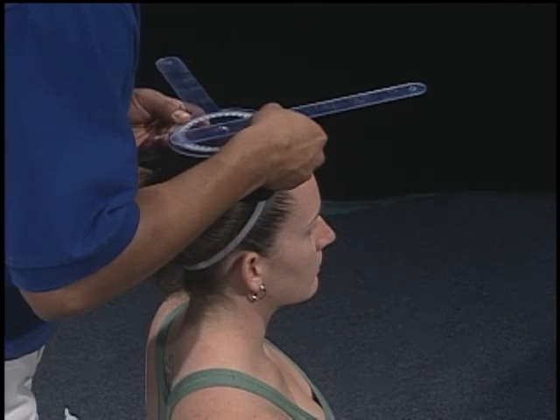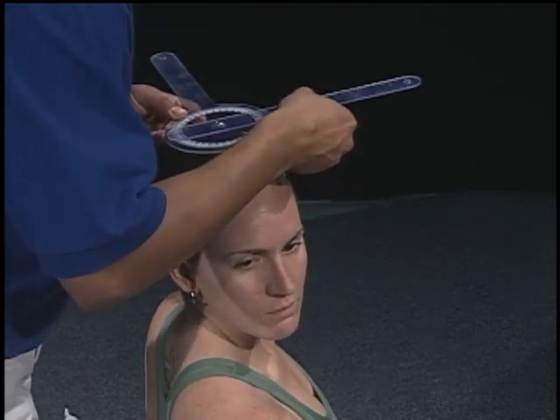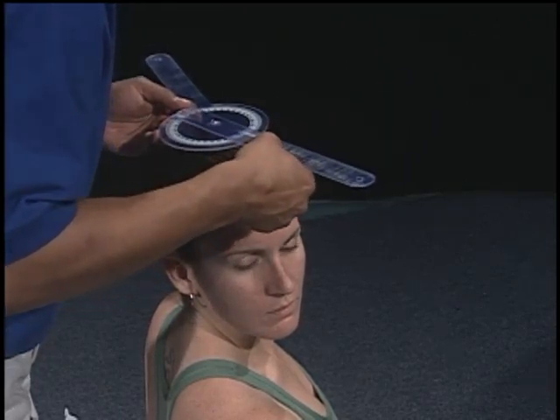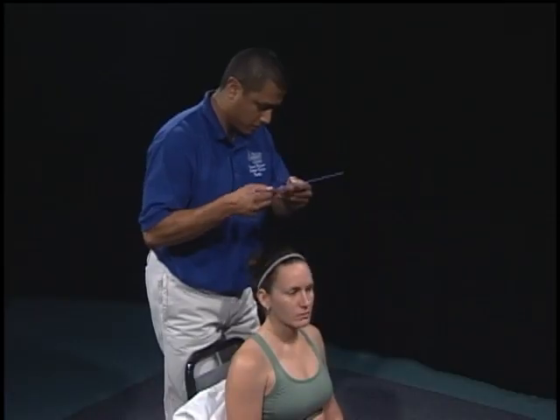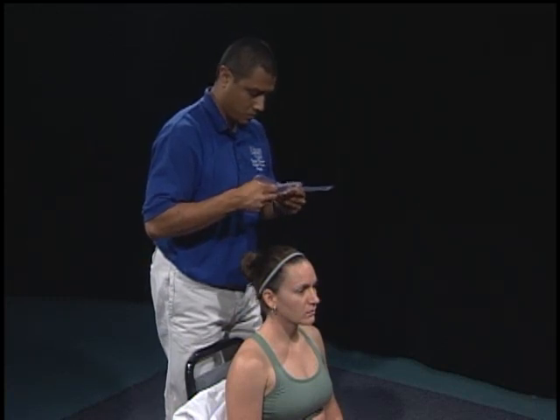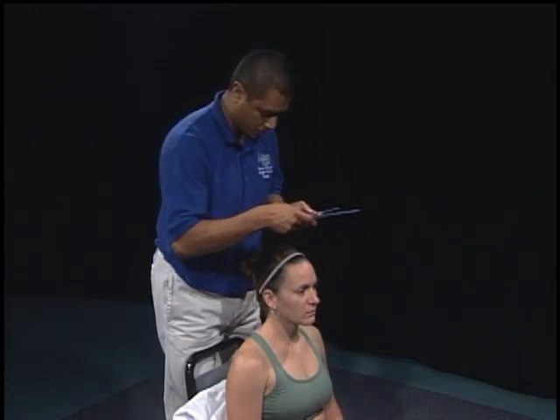Ask the patient to perform cervical rotation as previously, maintaining the goniometer in alignment through the entire range of motion, and observe for any extraneous movements of the trunk. Read the degrees of motion on the goniometer and then ask the patient to return the head to the starting position. Remain at eye level of the goniometer when reading the measurement.